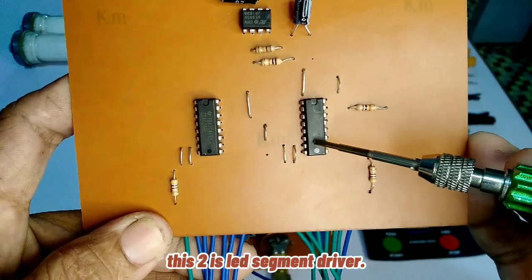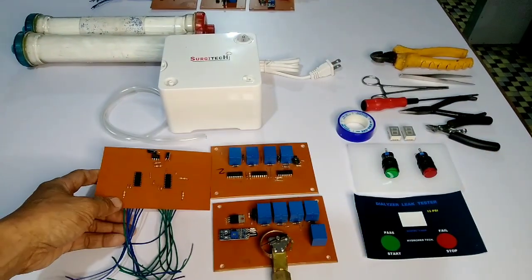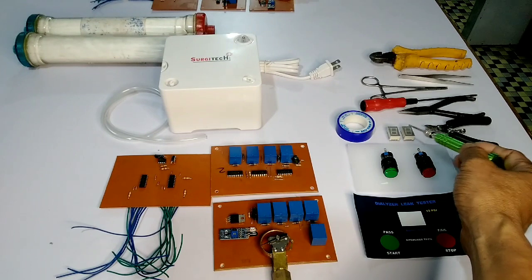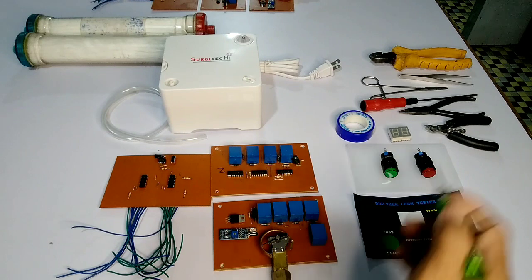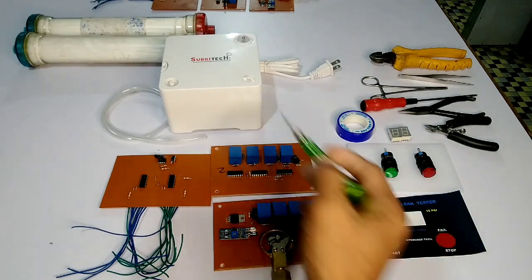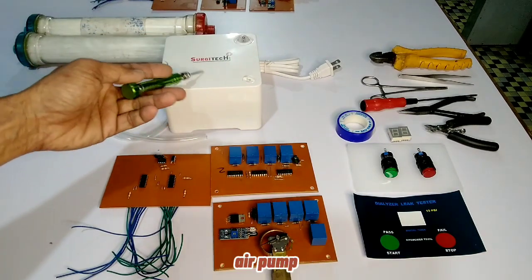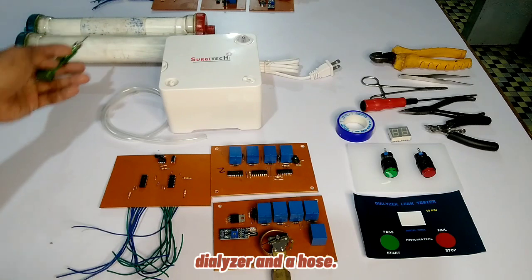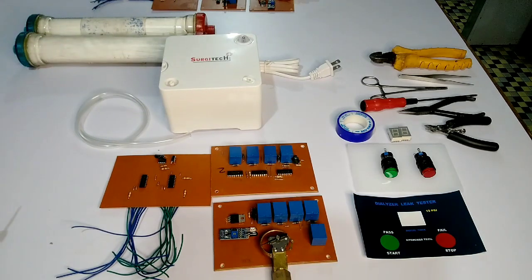These two are LED segment drivers. This is a common cathode display with start and stop button panel sticker. The components include the air pump, dialyzer, and a hose.